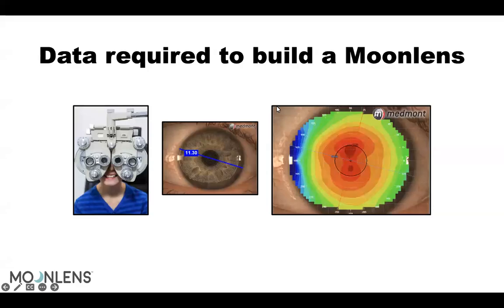So like I was telling you, Moonlens do have one exciting tool, and that is the ability to calculate your own lenses. And for that, we need some data.